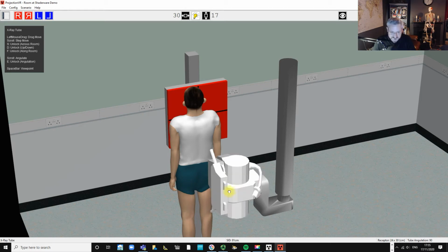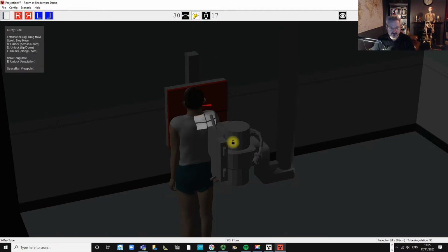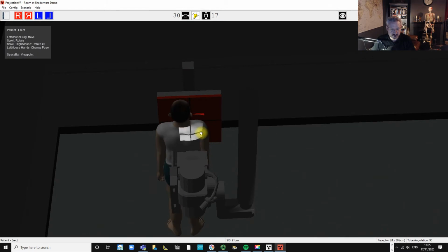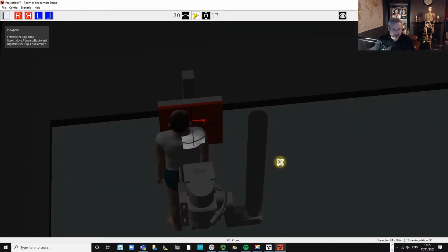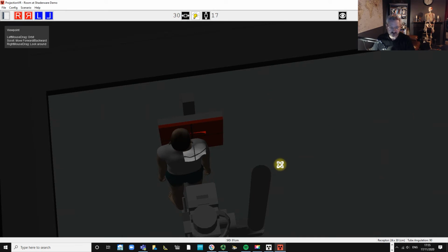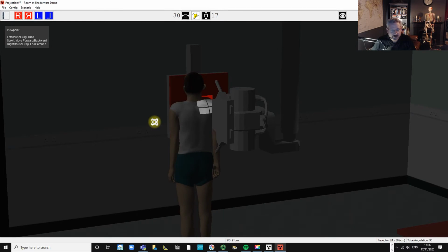Of course, we have to face the negatives, which is we can't actually see the clavicle, so we need to know some surface markings posteriorly, which will equate to the clavicles. So I mean, usually it's about an inch lateral to the medial border of scapula, but I would tend to just look for the point of the shoulder and make sure we include that, and the spine of scapula, which will allow us to get the medial end of the clavicle on. Okay, so I'm happy with that.